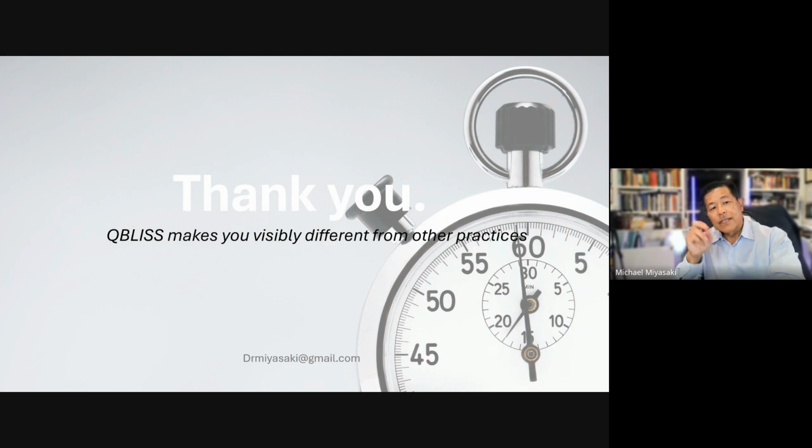But I just want to emphasize that QBLISS really makes you visibly different from other practices. And in the United States, like I think everywhere, being in dentistry is more competitive today. So we're always trying to find a way that patients will see more value in what we do in our practice. And I think the QBLISS technology does that very well.